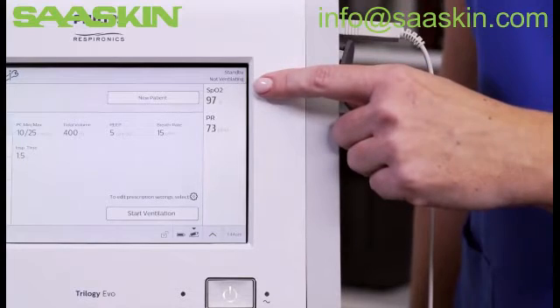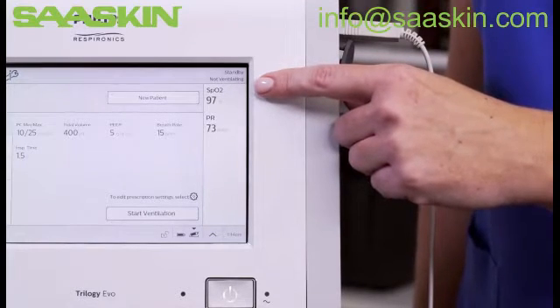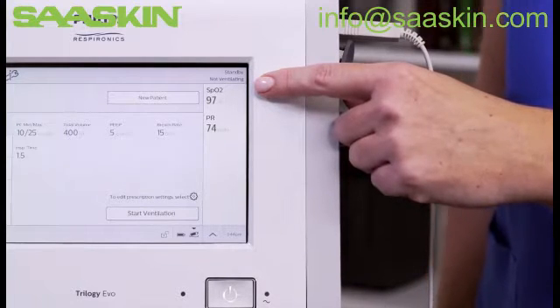You can see the SpO2 measurement in the monitor parameters pane and the pulse rate information in standby and various monitoring views.